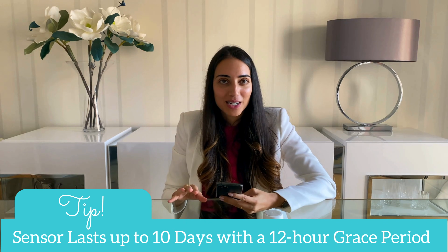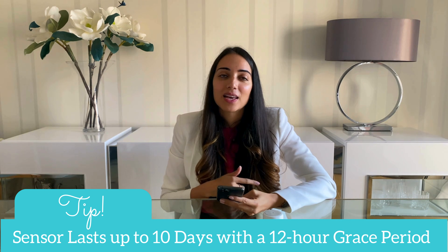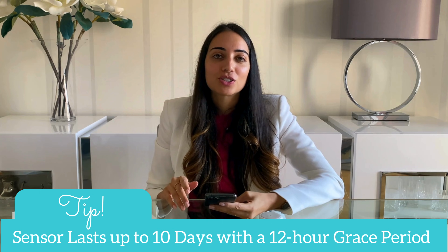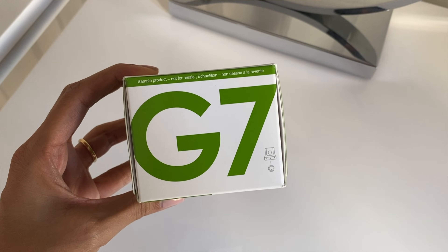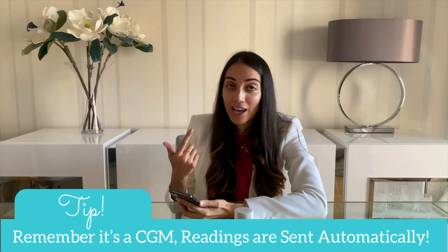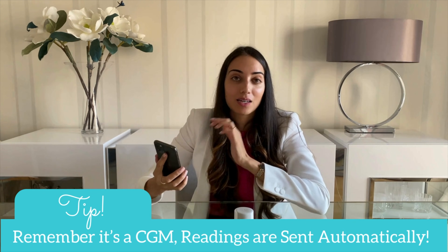An important counseling tip while we wait: the sensor needs to get replaced every 10 days. There is a very nice feature — the 12-hour grace period — that gives your patient the flexibility and convenience to apply a new sensor within 12 hours after the 10 days is complete. Because the CGM is continuously sending glucose readings from the sensor to the app every five minutes, it's unlike the flash glucose system where you have to scan manually; this sends it automatically.